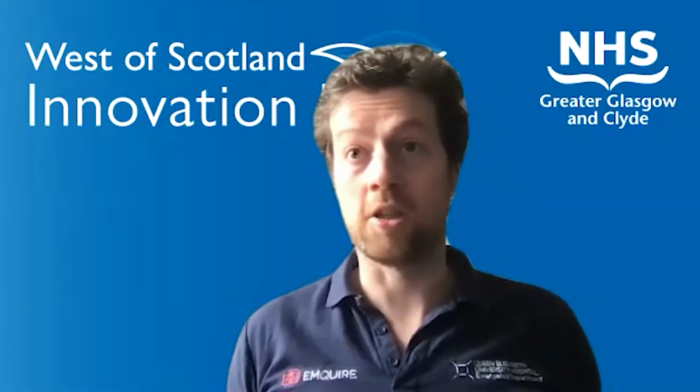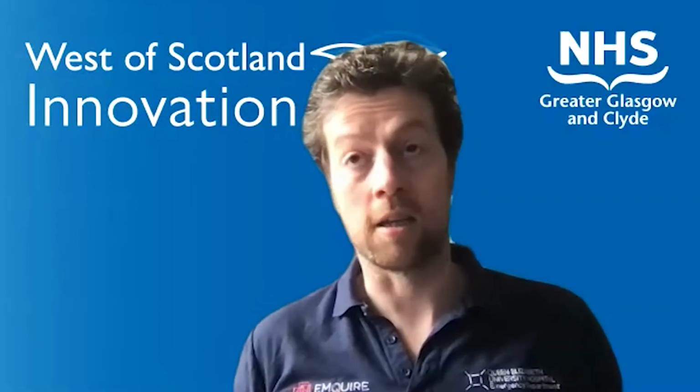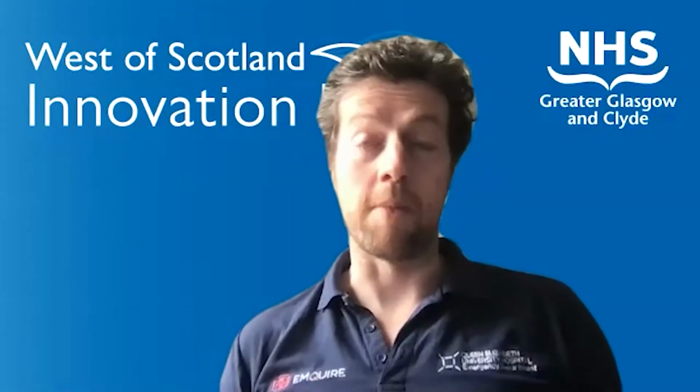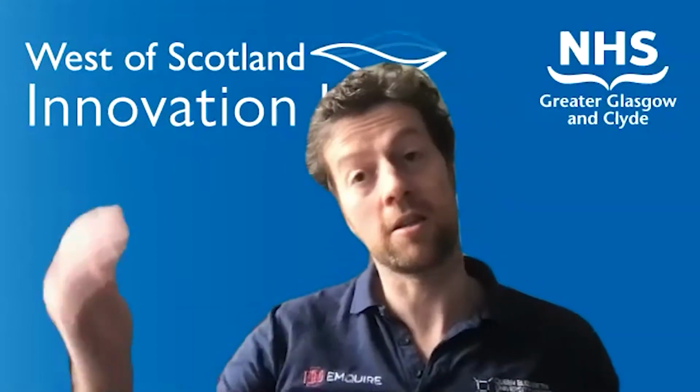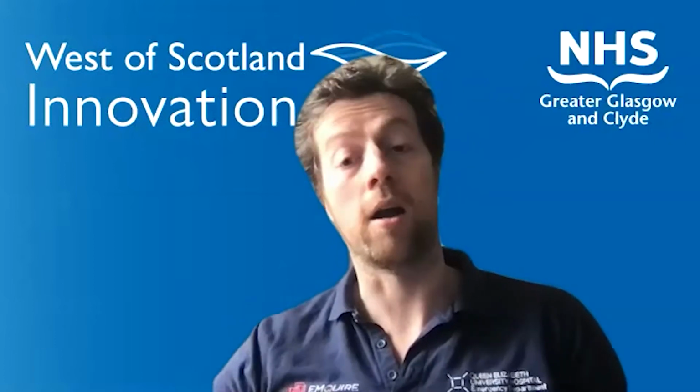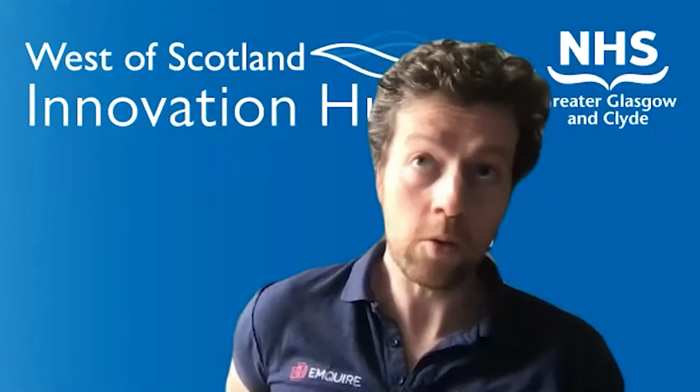I think over the course of the last year, what's emerged is that we're now doing point of care testing with COVID patients presenting into the emergency department, but chest X-rays remain a critical investigation in the examination and investigation of anybody with shortness of breath attending the emergency department. That's about 10% of our workload. And being able to differentiate, especially as prevalence of COVID drops, and to be able to support clinicians in identifying which is a potential COVID presentation is critical to both safety and, as we move forward, to identifying those that require additional screening, additional testing, and potentially cohorting, because obviously admitting a patient with COVID into a general ward can increase the risk of spread.